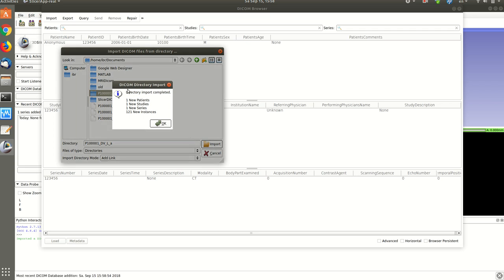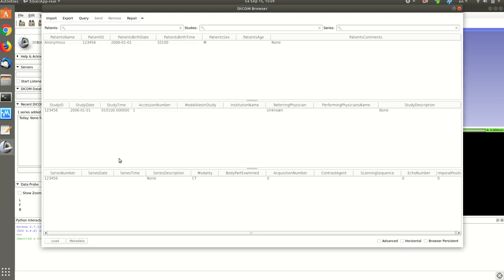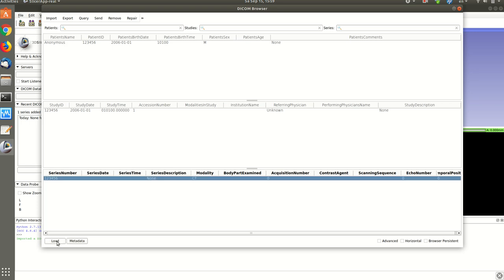And here we get some statistics. For example, we have in this folder one patient, one study and one 3D volume and 121 2D slices. Then I click in the 3D volume.